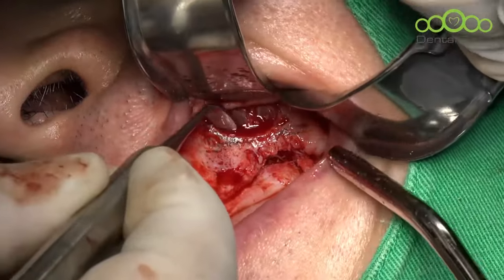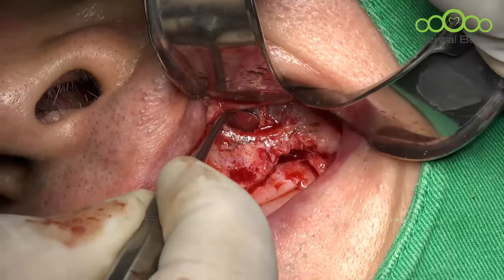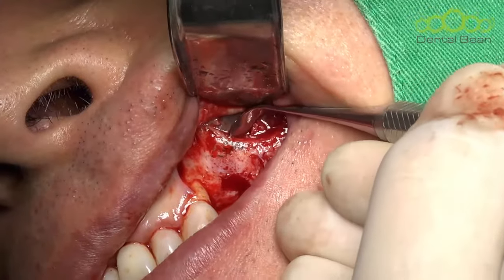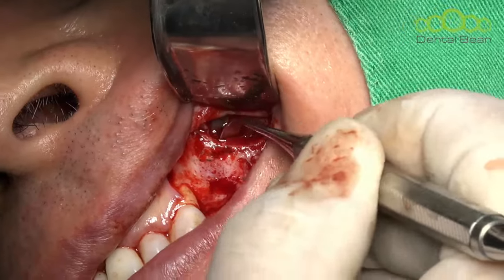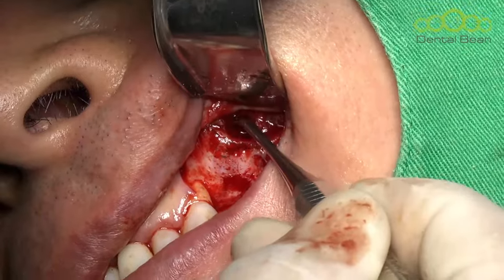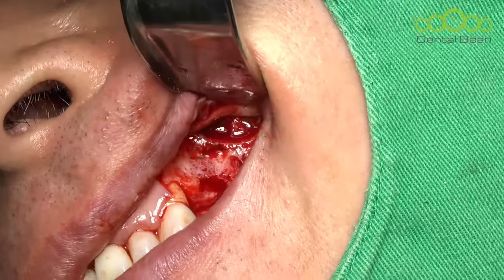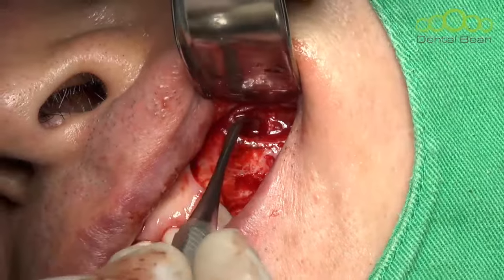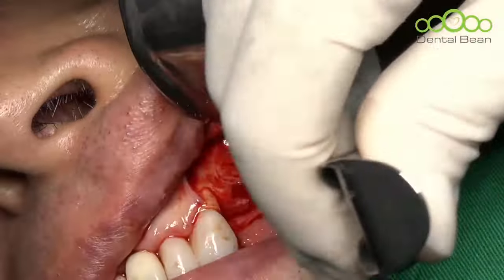First, I'll separate the anterior area. I must be careful. Here, anterior. Generally, I start with this tubercle first, but in this case, because of the septum, I may need to make it larger. This window looks too small. It's very difficult to work in such a small window. Because of the septum, we cannot access like that. Better to enlarge the window.